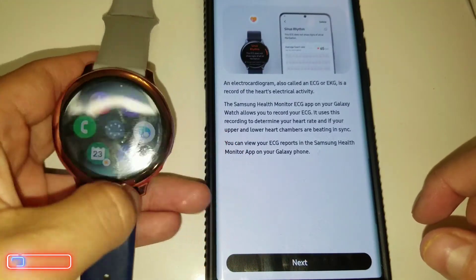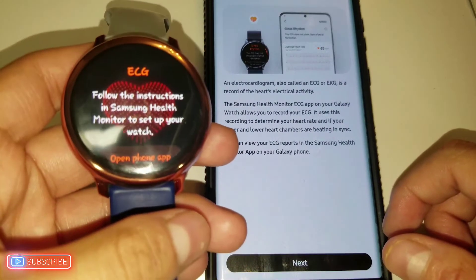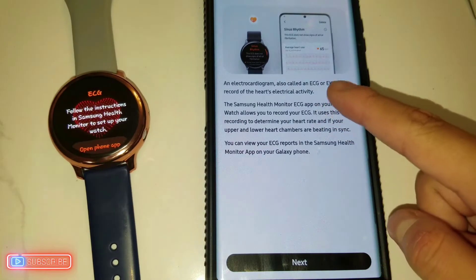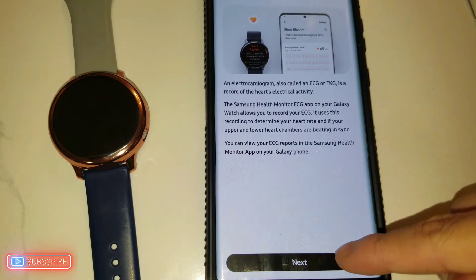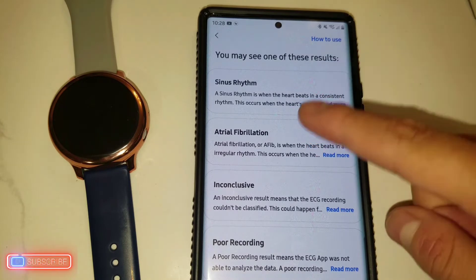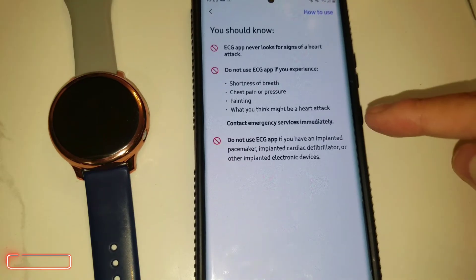You click 'Get Started.' On the watch, open the app and it will show the ECG screen with instructions to set up in Samsung Health Monitor. On the phone, clicking next gives you detailed information. You may see one of these results: sinus rhythm, atrial fibrillation, inconclusive, or poor recording. You click next to continue.